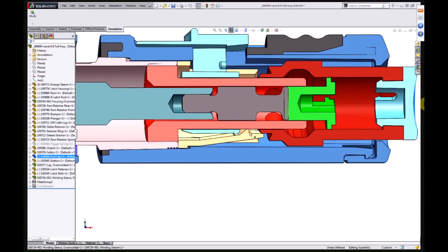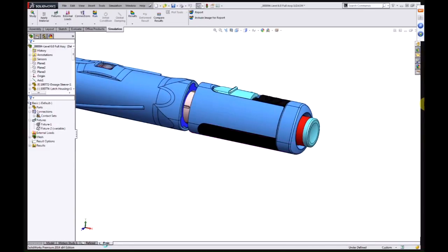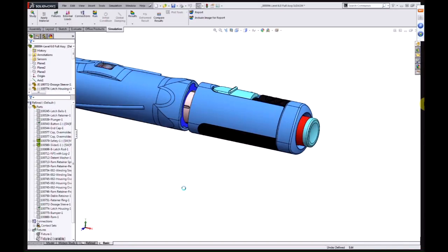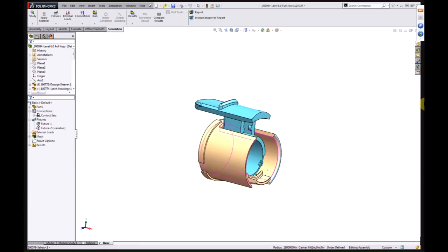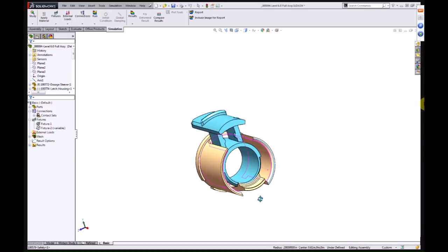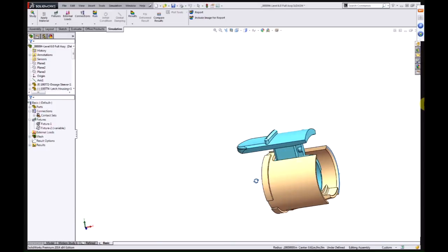And so I've looked at two of the parts here in isolation as part of a secondary analysis. See if we can get those parts on the screen here. There we go. Okay, so I'm just considering the two parts, one on top of the other, and I'm really wanting to understand how this part moves past the clip and how that clip engages, and whether I have sufficient strength in the root of this little clip fit item in order to perform the action I need.